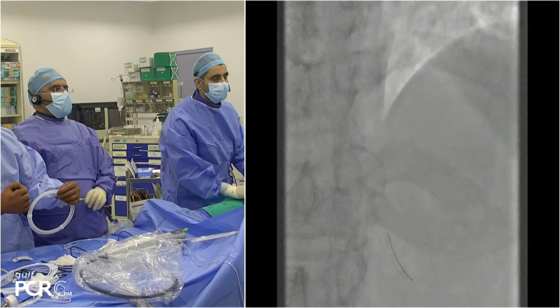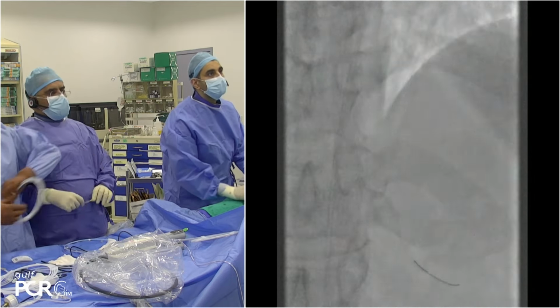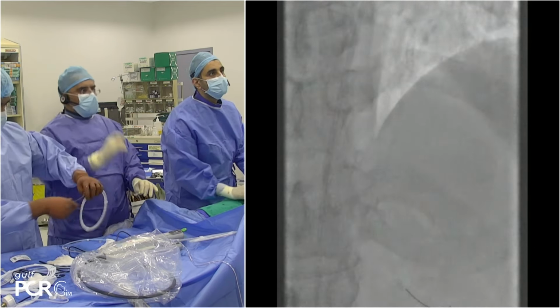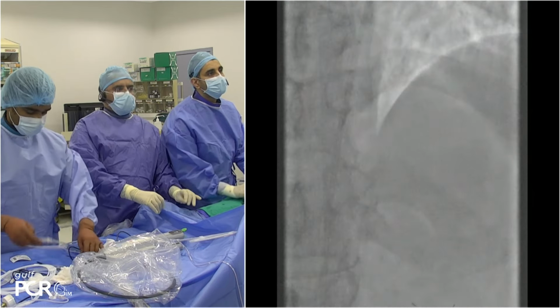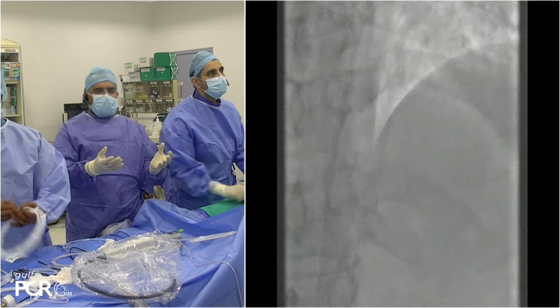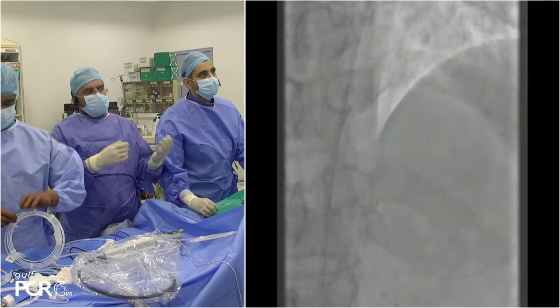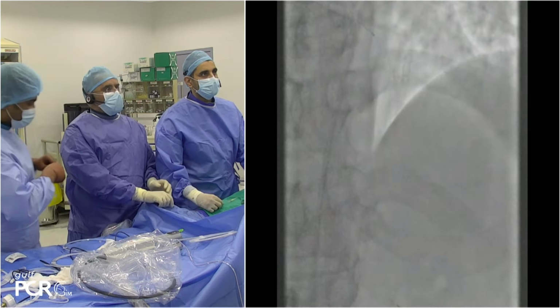So, Ibrahim, we choose the orbital over the rota in certain situations. One, as Abdullah said, in big vessels, when the burr of the rotablation is too small for the lumen. And the other thing, if you have a size discrepancy, so the distal vessel is different than the proximal part that you need to ablate. So you use it for both, with different speeds, one crown for both.